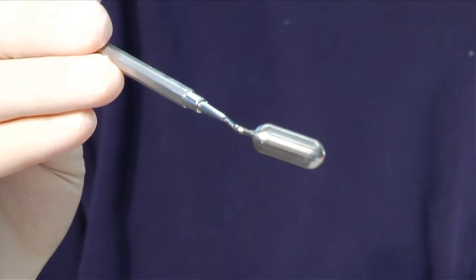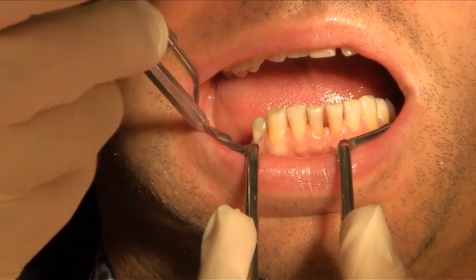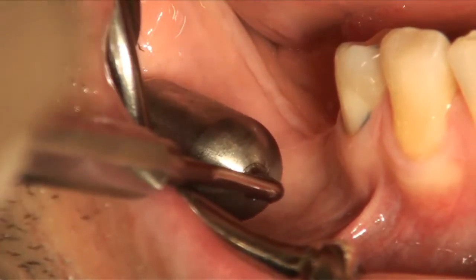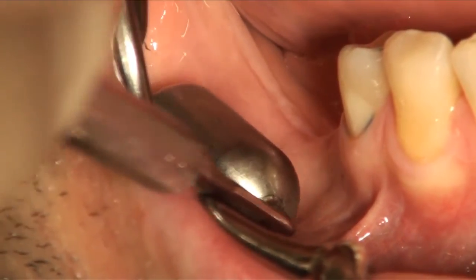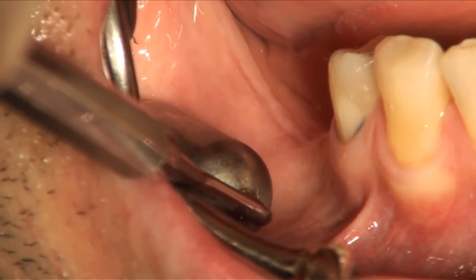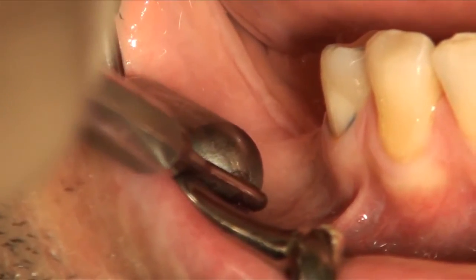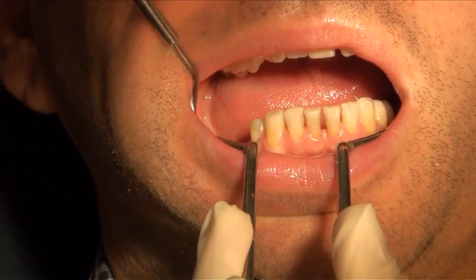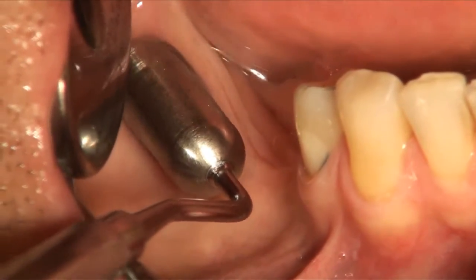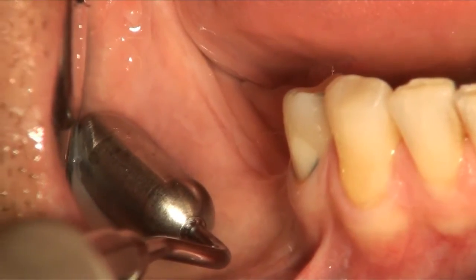The appropriate size of the expander is selected using a surgical template. This side of the template corresponds to the final volume of the expander. This is the final volume of a 1.3 milliliter expander, and as you can see, the final volume might be too big because the expander might come into the ascending part of the mandible. So we will try a smaller expander, for example, 0.7 milliliters. And this expander may be appropriate.